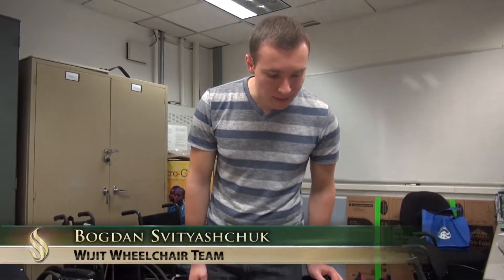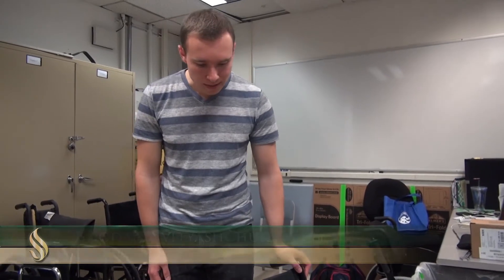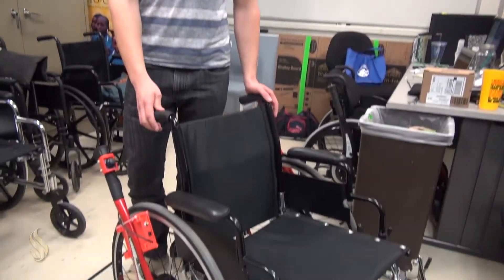This product came from cooperation with Brian Watwood. Basically, we just added some components to make this chair be able to be used by a person who has only one healthy arm.